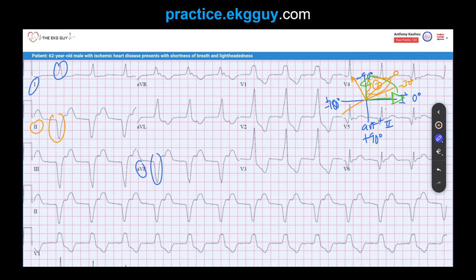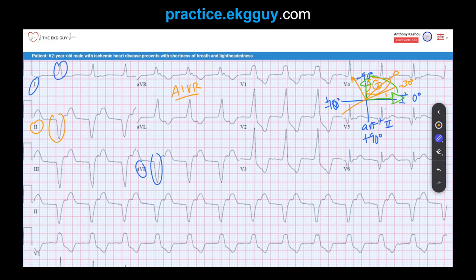The answer was accelerated idioventricular rhythm. The ST changes are likely a result of that, but consider it clinically if needed. AIVR occurs when an ectopic ventricular pacemaker rate is greater than the sinus node rate. It's usually due to increased ventricular pacemaker automaticity but can be triggered by ischemia or digoxin toxicity. It requires at least three wide QRS complexes, with morphology often similar to three PVCs in a row.